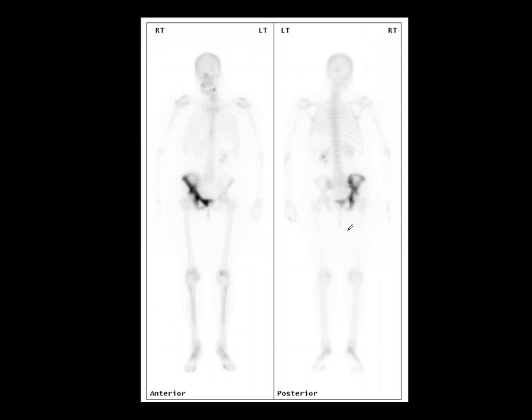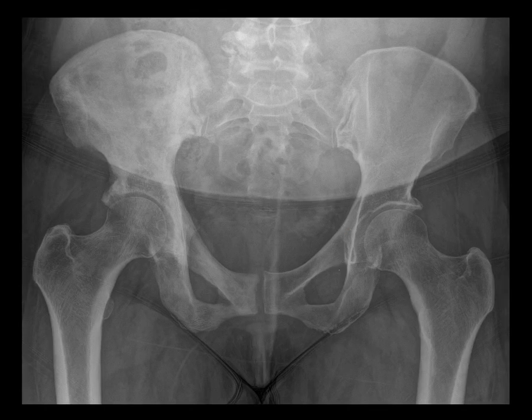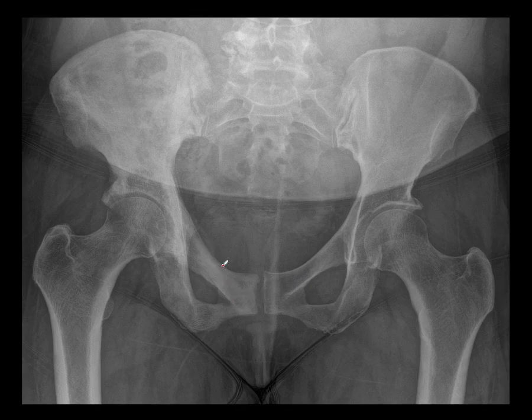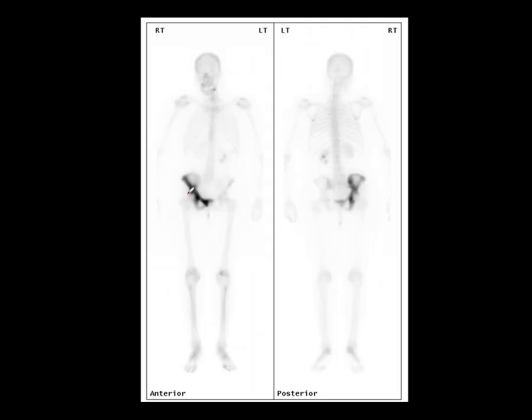Metastases quite often present as round areas which destroy bone and pass through it rather than conforming to the shape. On x-ray, the signs we're looking for in Paget's disease are cortical thickening, thickening of the trabeculae, and enlargement of the bone. There's sclerosis here with thickening of trabeculae, which is certainly very suggestive of Paget's disease, and this is quite a typical appearance in conjunction with the scintigraphic findings.